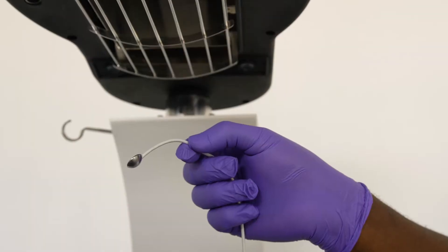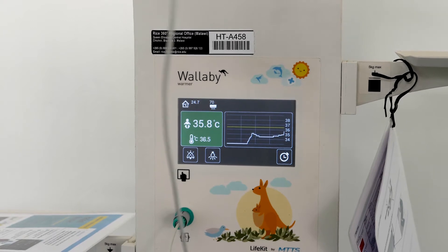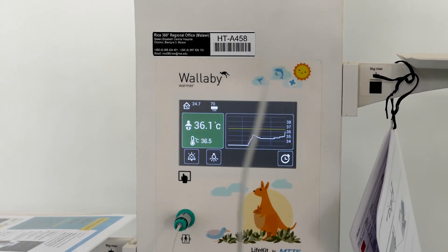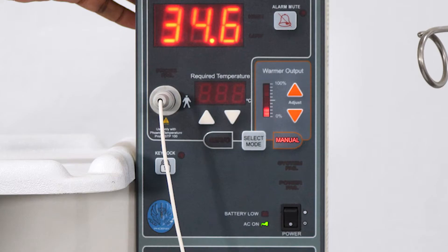You should be able to feel the heat and you should be able to see the temperature reading on the machine increase. Once you are sure the machine is working, you need to leave it for 10 minutes at 20% heat to pre-warm the cot.